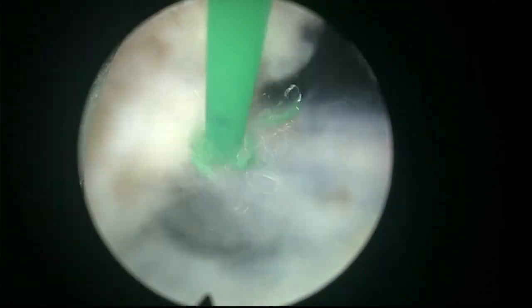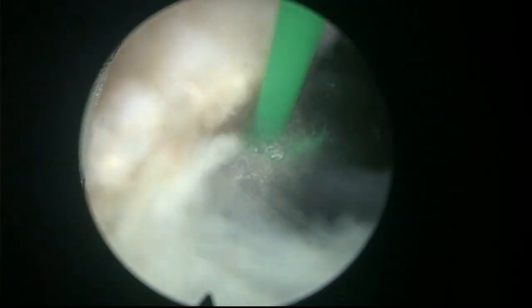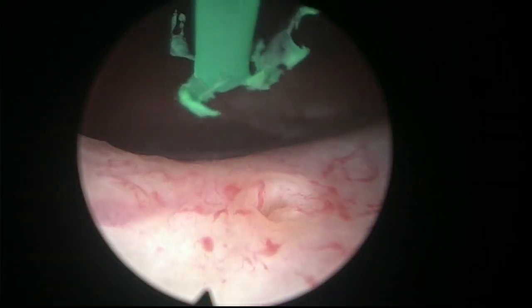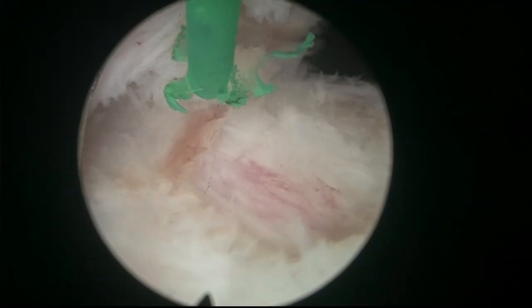Here we are. Let's see if we managed our objective. I'll go in to check the position of the UO here. It's quite safe, and now we have taken the battlefield a little bit more medial. So we can release this tissue without damaging the UO.